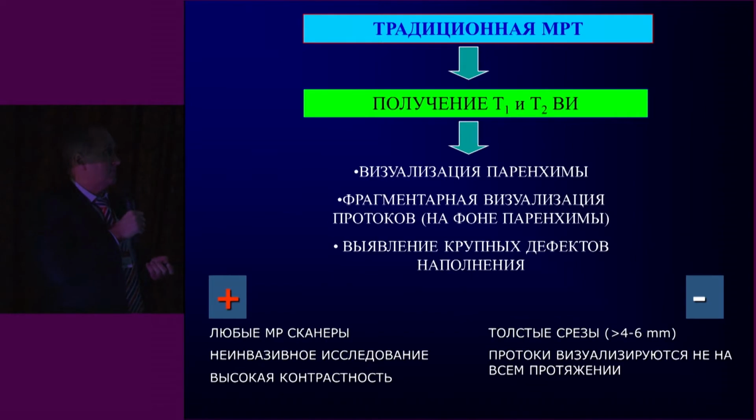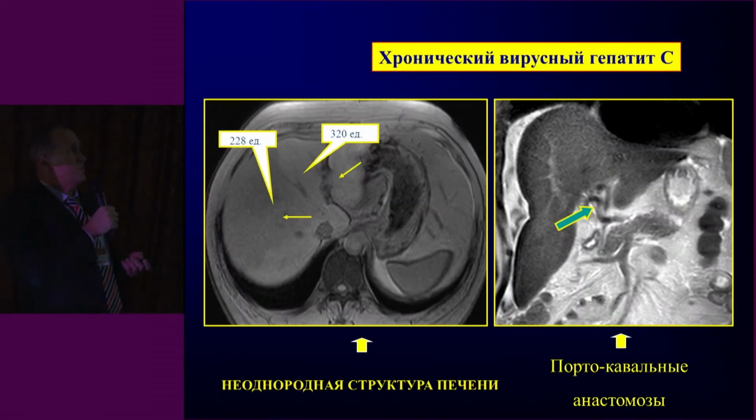These methods are rapidly developing. It's MR spectroscopy and MR elastography.